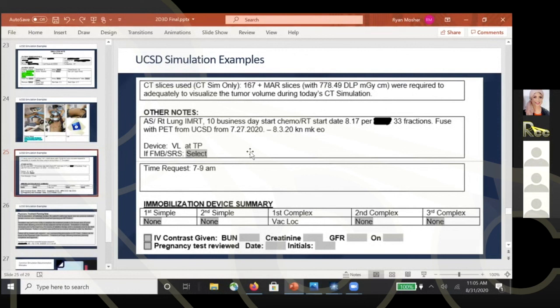Well, I'm not quite understanding the question. I mean, when the patients go before the surgery to the MRI department and then to the CT simulator, and after that I will fuse them together, the positioning is different. So how can you deal with that? Yes, that's a good question. There is computer software.